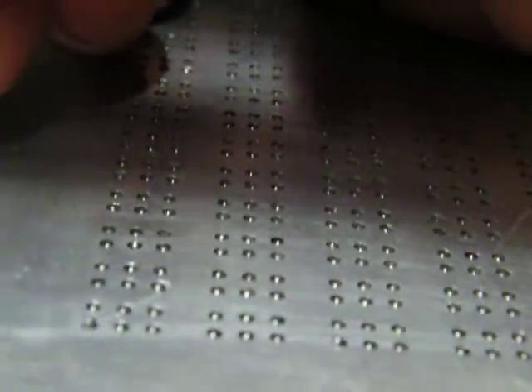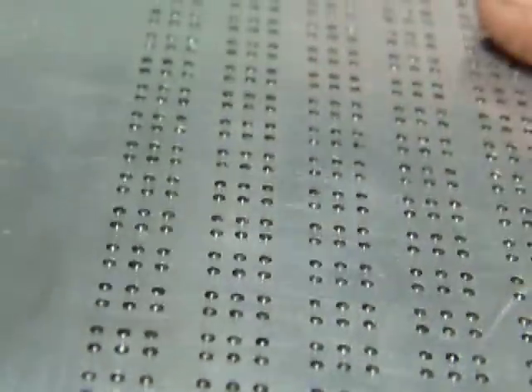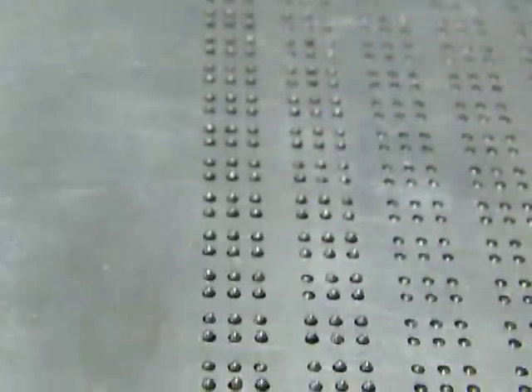1 and 3, and suppose I want to actuate all the rows at a time. I'm just enabling a couple of rows so that I can set a whole bunch. I can show you a bunch going up. Can you see them jumping? That's how they would jump. There's one fellow who's stuck over there. I don't know why he's stuck.